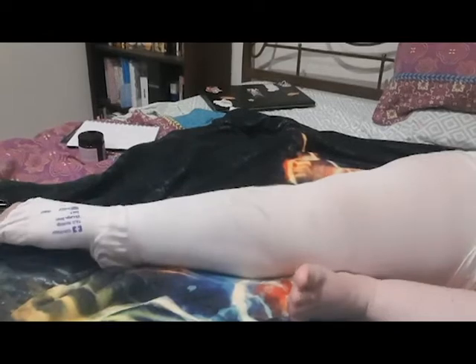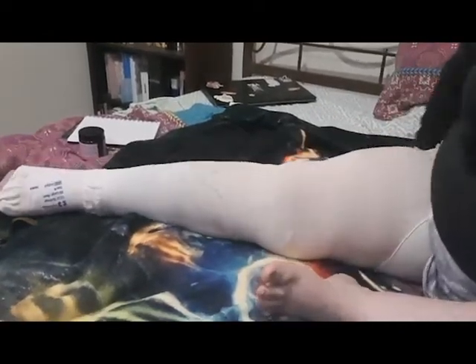And pull it up right up to the very top of your leg, and that is where you smooth it out. Now, it's really important that you smooth it out all around your leg. It'll start off feeling fine and you won't notice it, but after a while it'll start to get irritated, and that shiny bit of fabric that prevents it from rolling down can catch your skin. My skin has gotten quite delicate, where it has actually taken off the top layer of skin, and it's almost like I've got a very slight burn, like I've scalded myself. So please be very careful of that.